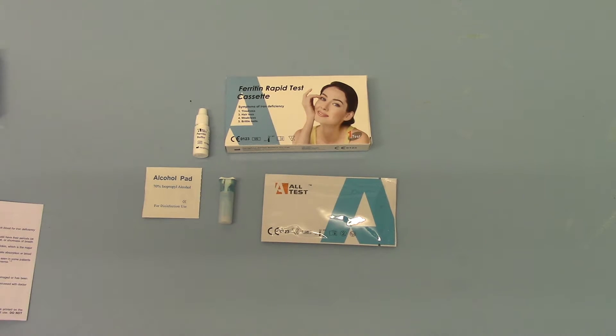Welcome to this product demonstration for the new AllTest Ferritin Home Test or Self-Test Pack. This is a complete home test including a lancet to do your finger prick to determine whether you have a low level of ferritin or an iron deficiency anemia.